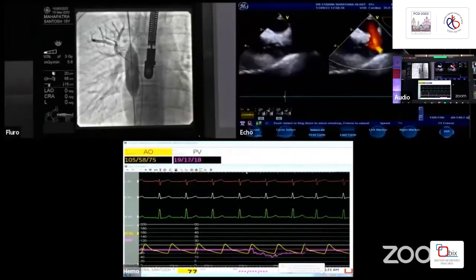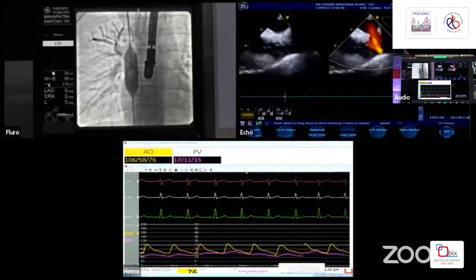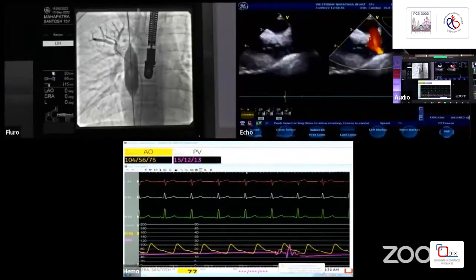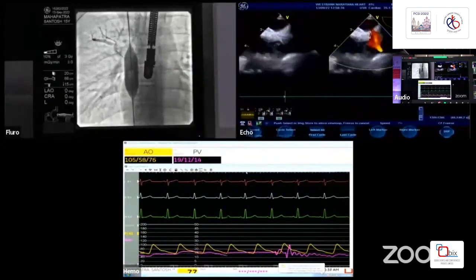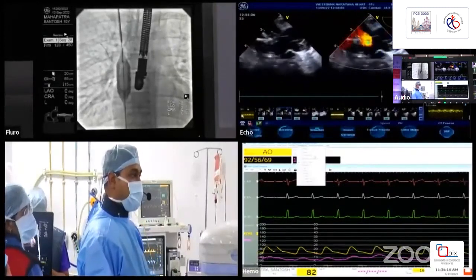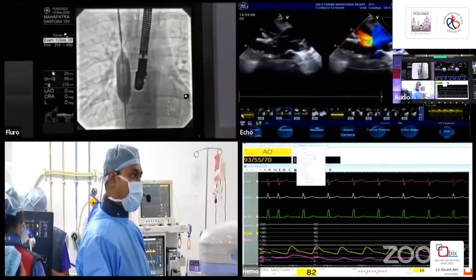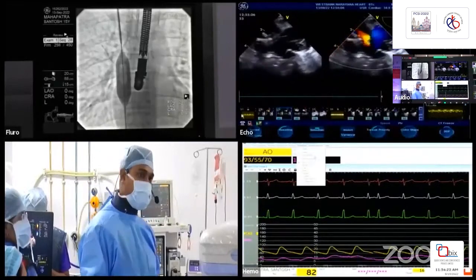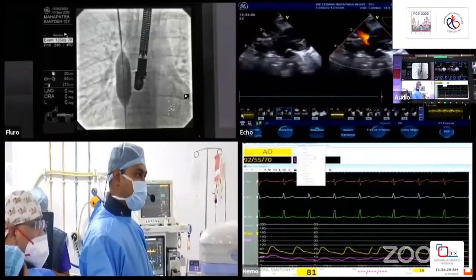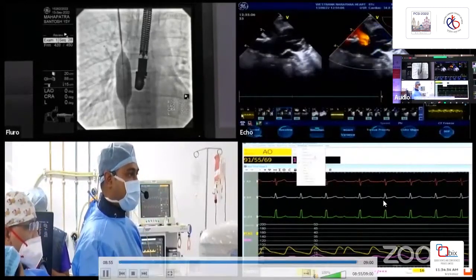Pulmonary venous pressure is now 17 to 18 mmHg, and flow acceleration across the right upper pulmonary vein is clearly demonstrated on transesophageal echo. Every attempt has resulted in pulmonary venous obstruction — we downsized the balloon to 20 mm but still have significant obstruction. This child is therefore not suitable for transcatheter closure of the sinus venosus ASD. We are abandoning the case, and this child will likely do well with surgical closure.